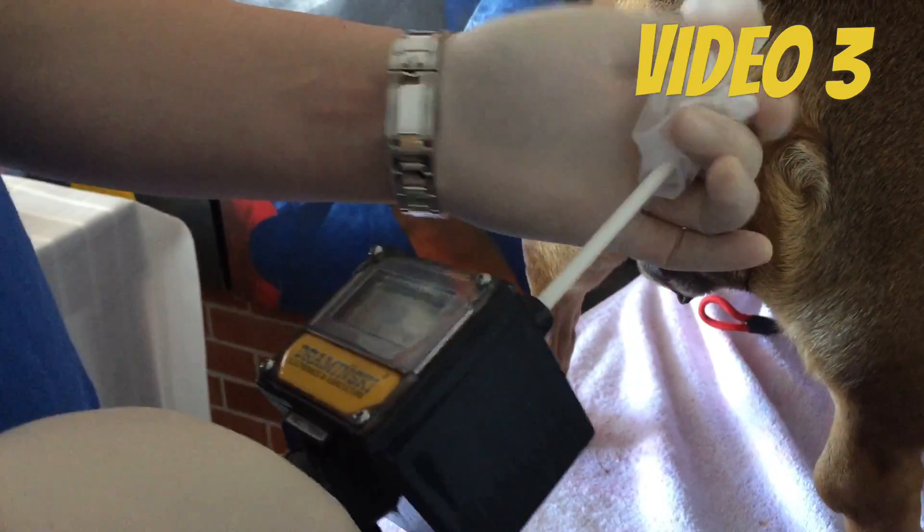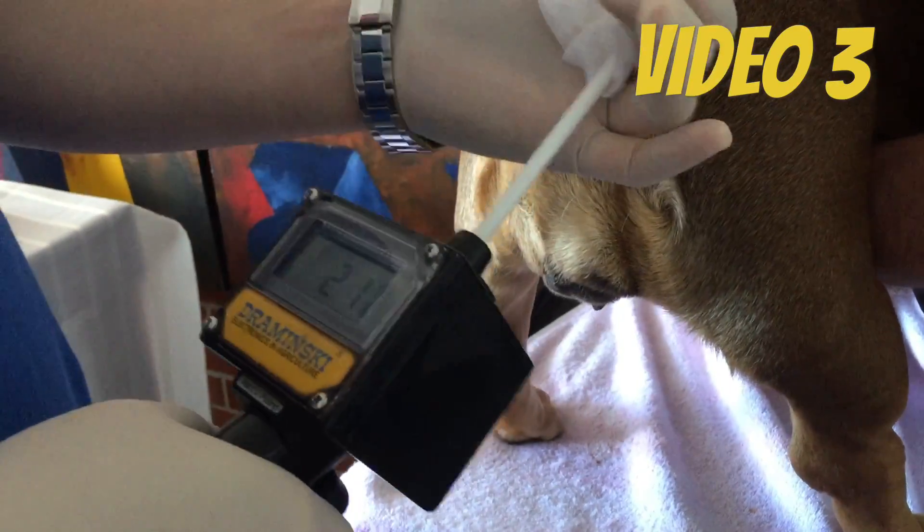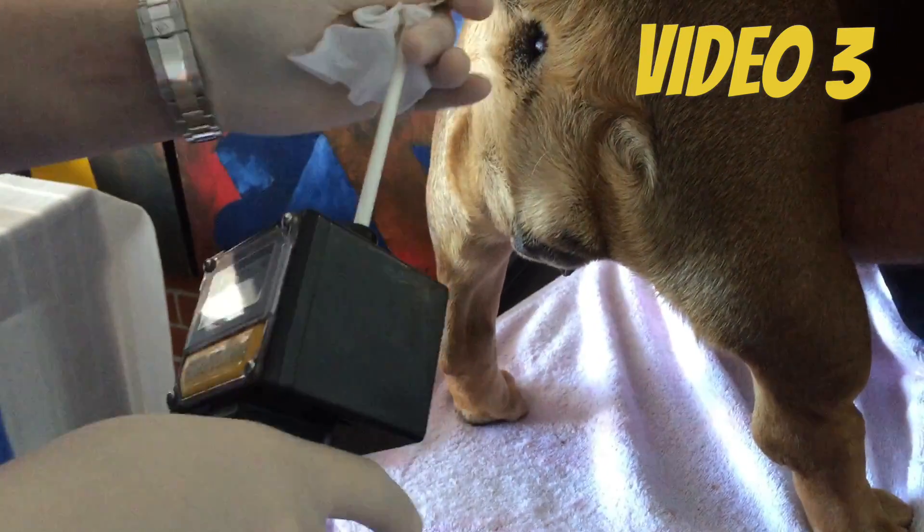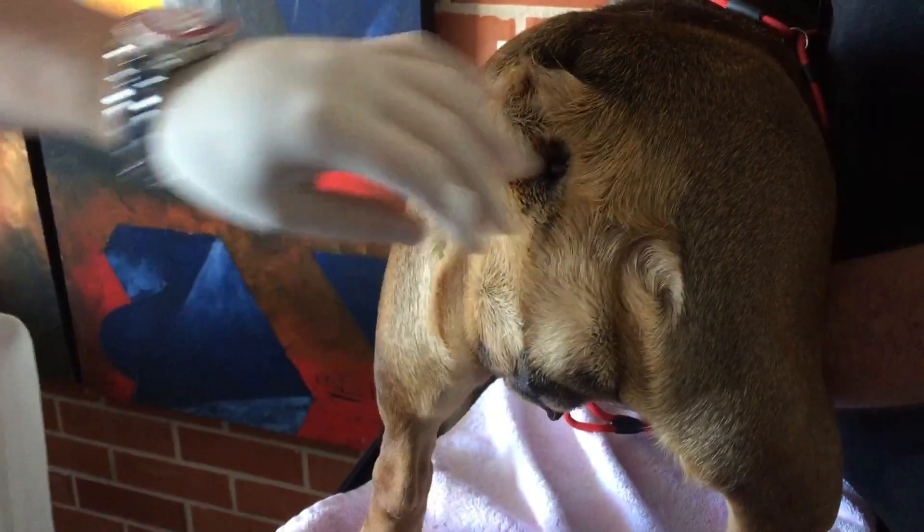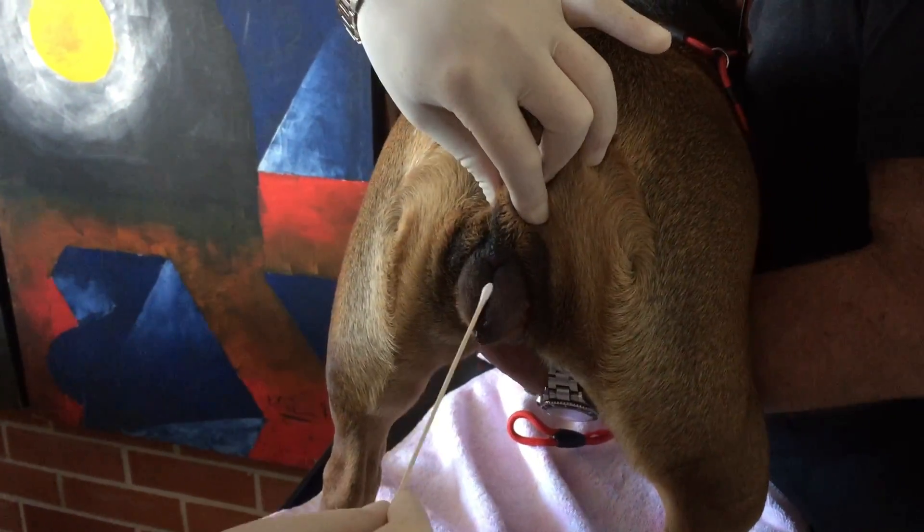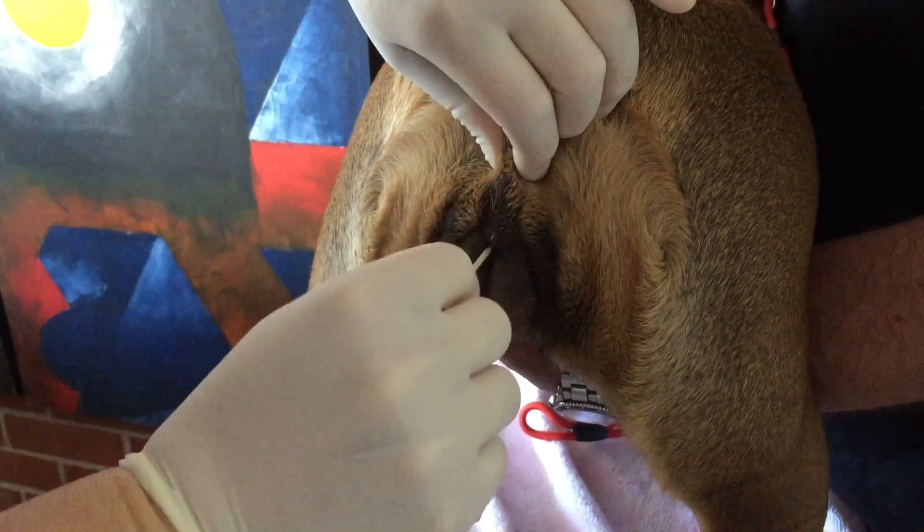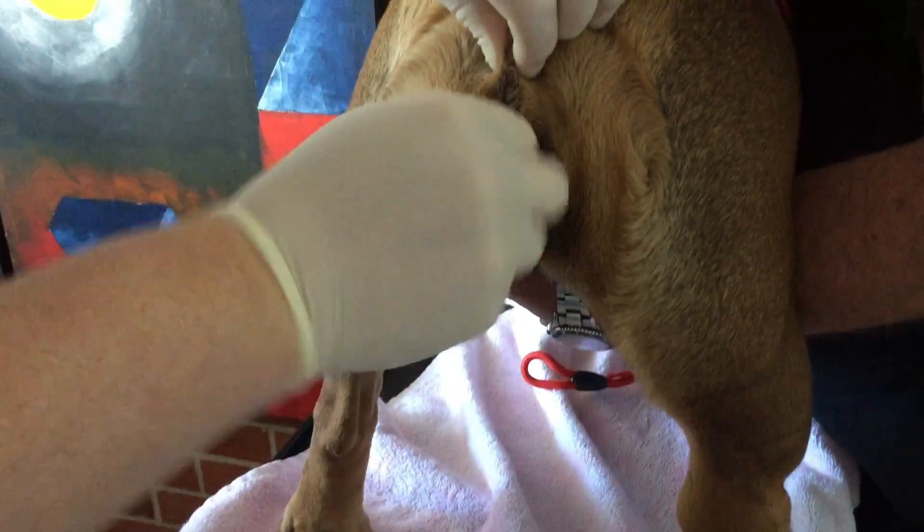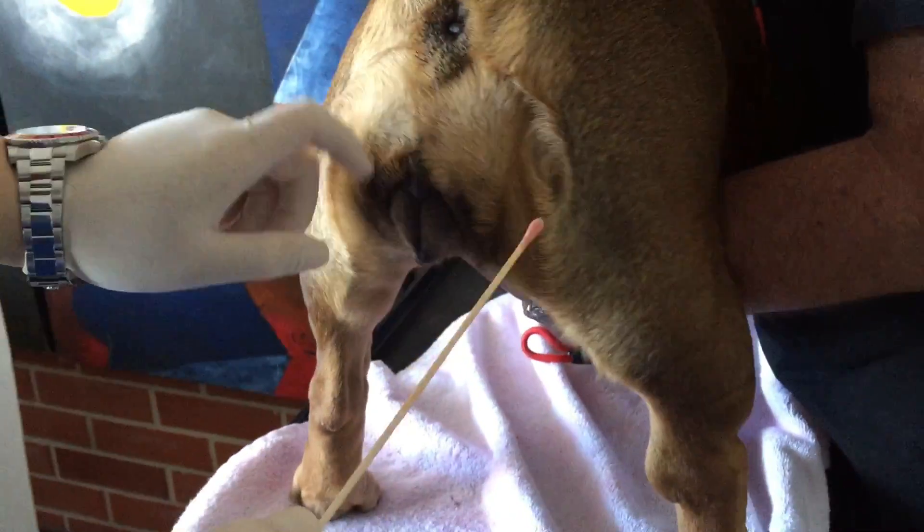So this means that there was already an LH surge and progesterone levels, as our progesterone machine told us yesterday, started to rise. So now let's go and do a vaginal smear. Okay, so we're gonna do the vaginal smear. Now you can see that she's bleeding still and then she's flagging, she's receptive.